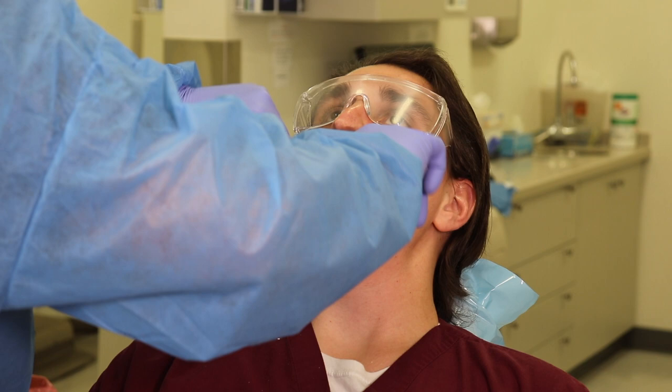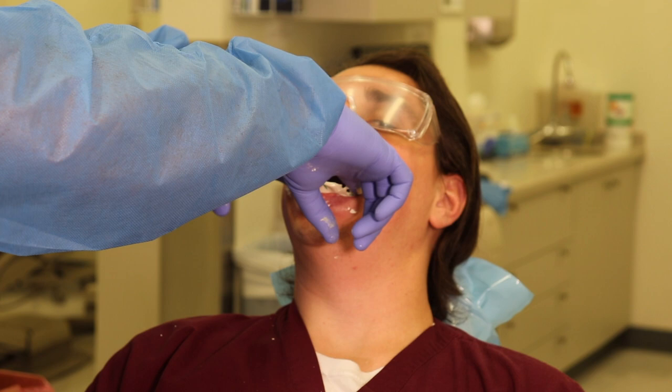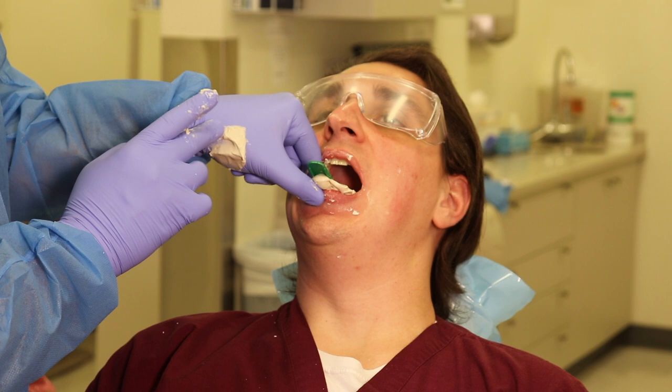I ask my patient to lift up the tongue. Good job. I make sure I stretch out those cheeks here. Okay, and I hold it. Now, I have a little bit here that will tell me, is it getting ready or not?